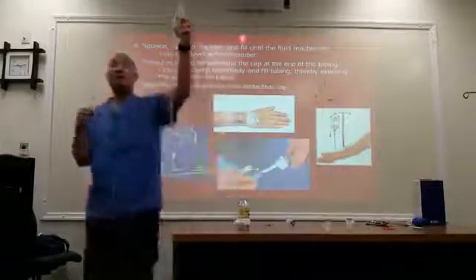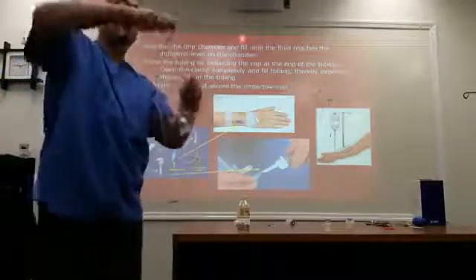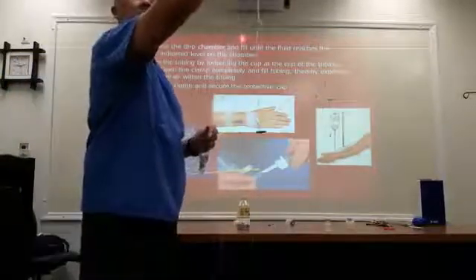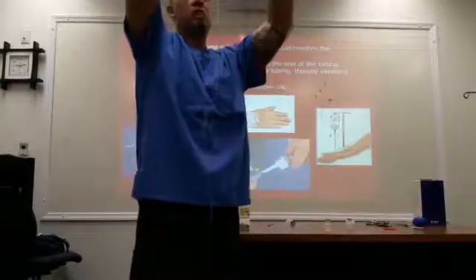Contrast comes in various forms. It can come in a bottle, it can come in a bag. But we're going to take the spiked end and just put it in, make sure it's nice and sealed.